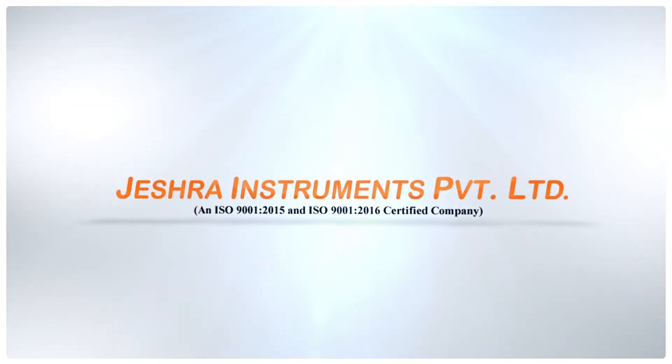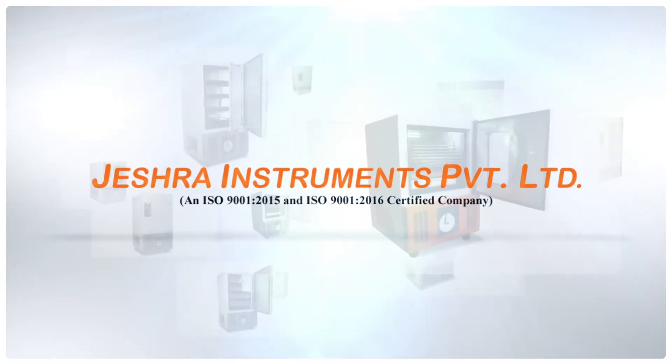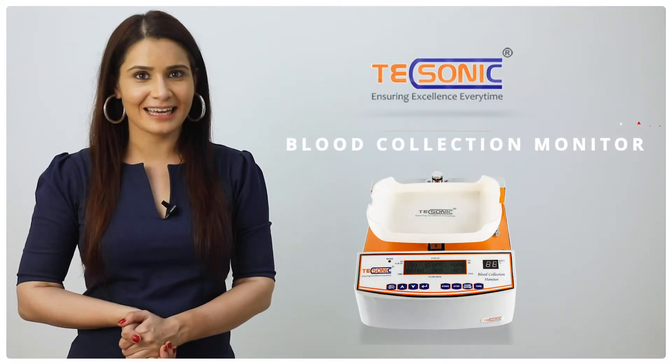Hello everyone, welcome you all to Jayshra Instruments Private Limited, one of the leading manufacturers of blood bank equipments. Presenting to you Texonic Blood Collection Monitor.